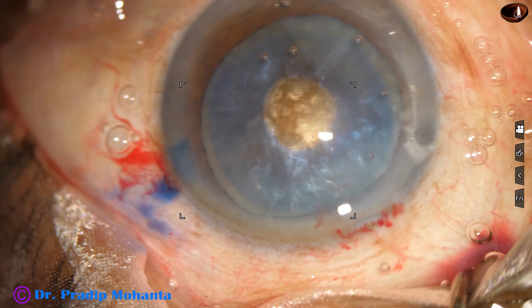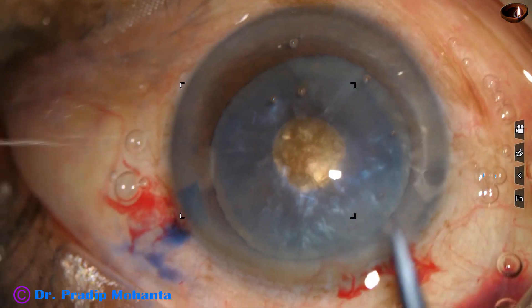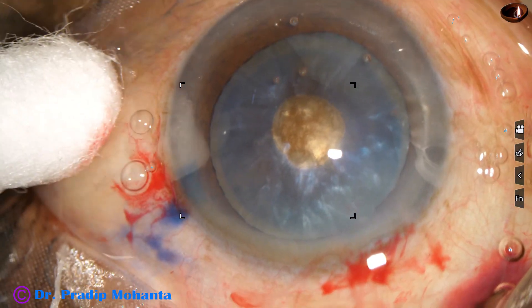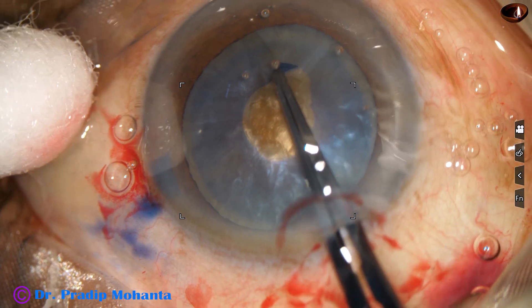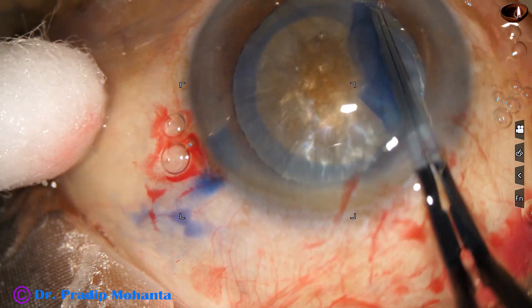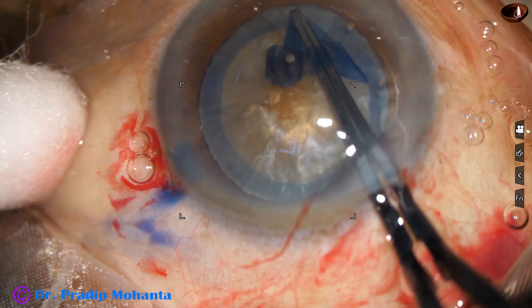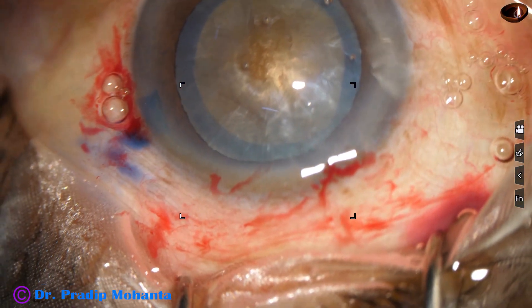Now, inject visco again, take a Vanna scissor and make a small nick at the margin of this mini rhexis at around 7 o'clock. Now I use the utrata forceps again and do an adequate size capsulorhexis. Nucleus is hard and I did a rhexis of about 6 mm.